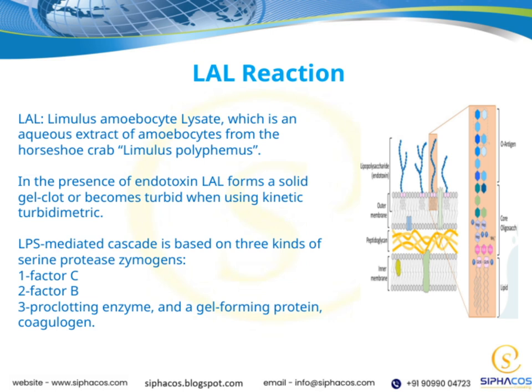Now, when endotoxins are present, the LAL reacts in a very distinctive way. It either forms a solid gel clot, or, if you're using the kinetic turbidimetric method, it causes the solution to become turbid. This change is actually the basis for detecting and quantifying endotoxins in various samples.